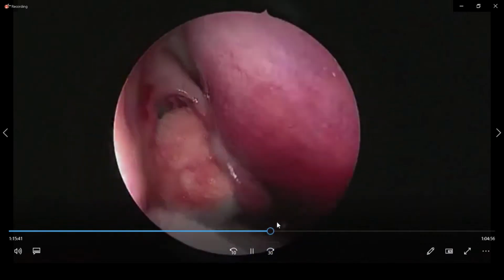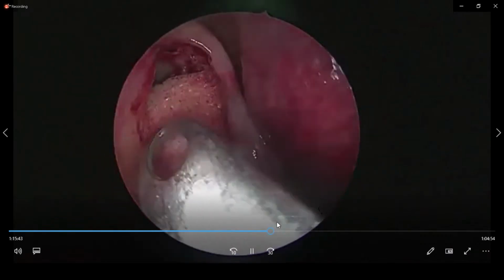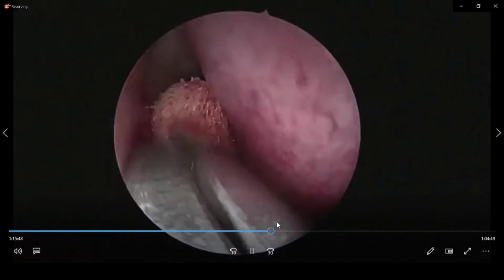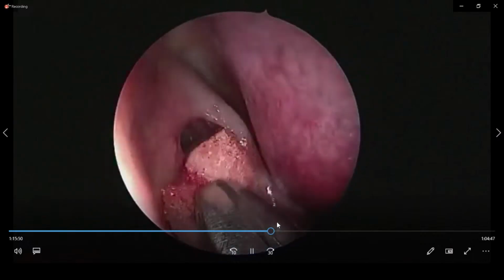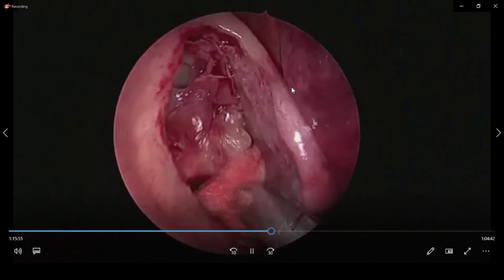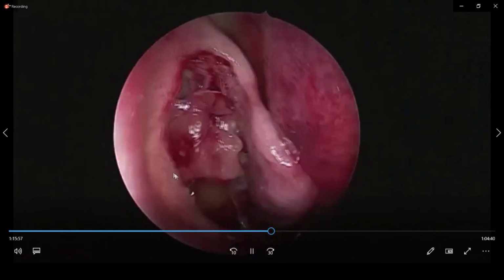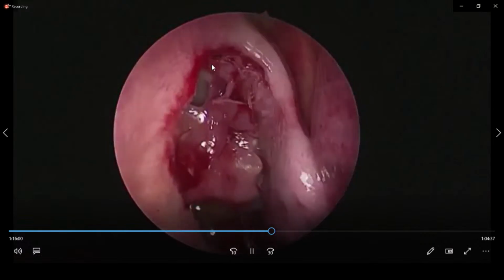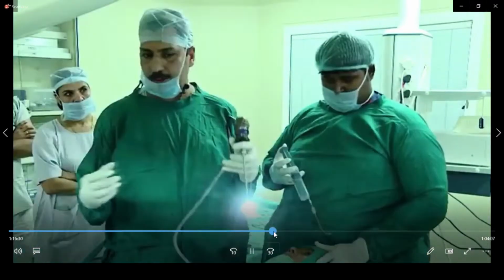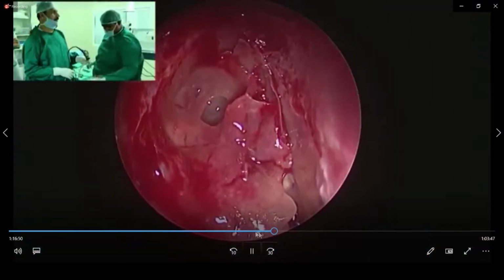The frontal sinus is a very, very key sinus, a challenging sinus for surgeons for many reasons. See this repeated morsellized cells, and here we change to the 70 degree to look up, to follow the intact bulla technique, which was initially propagated all over by our own Dr. D.S. Sethi from Singapore. See, this bulla goes up to the skull base, and as it goes to the skull base, it covers the anterior ethmoidal artery. Now I am with the 70 degree.